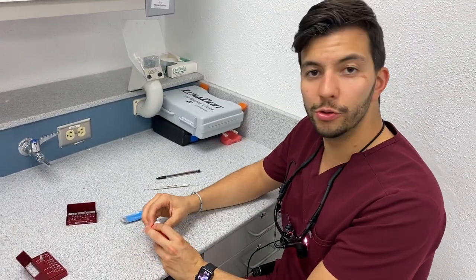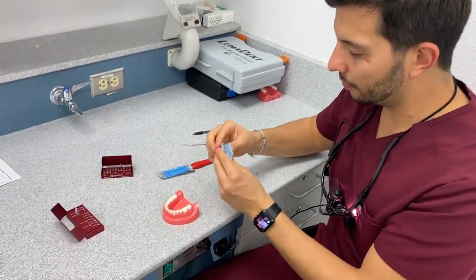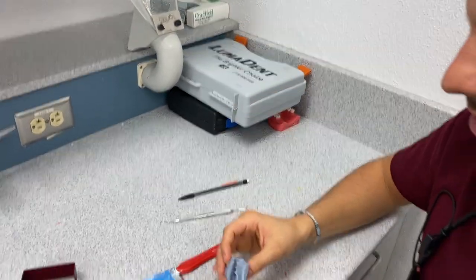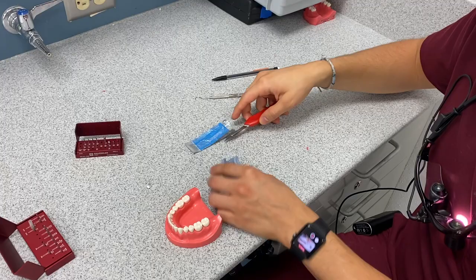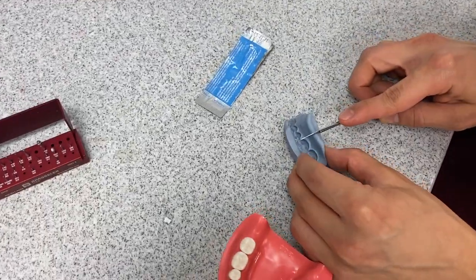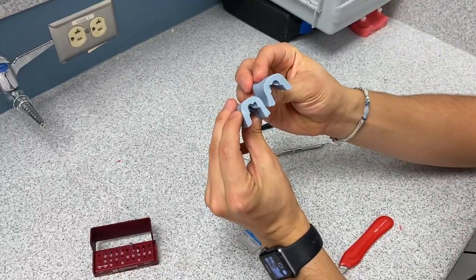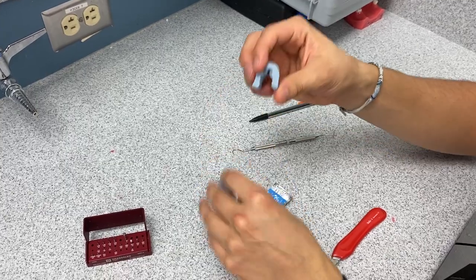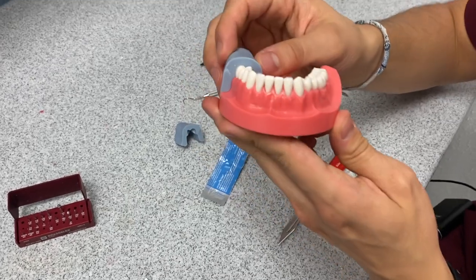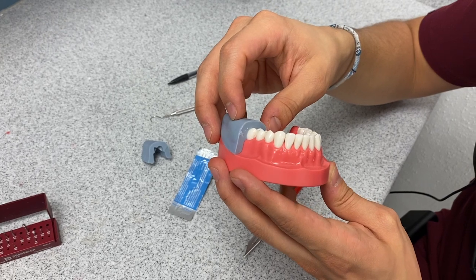It's been about two or three minutes — it's now fully set. I can feel that it's hard, so you can just come in and remove it. You want to look at the occlusal and make sure it's nice and defined. The next thing we're going to do before starting with the crown prep is to get a #25 blade and make a cut right down the middle of it. Now we have it split right down the middle and we'll be able to really seat it in there — right there you can see there's no reduction, but this is what's going to help us see how much we've reduced.